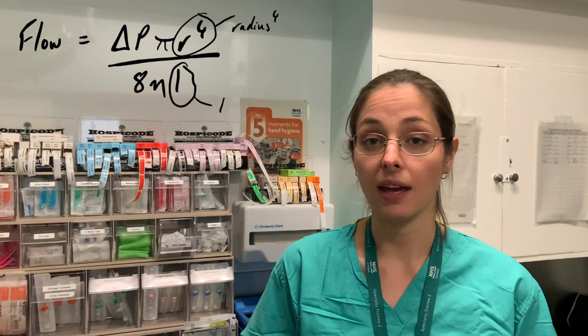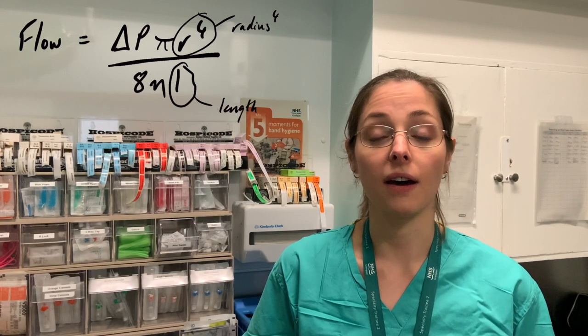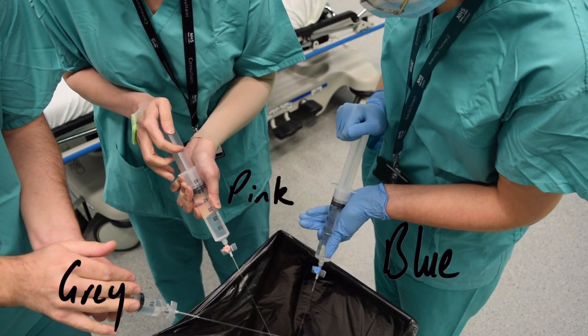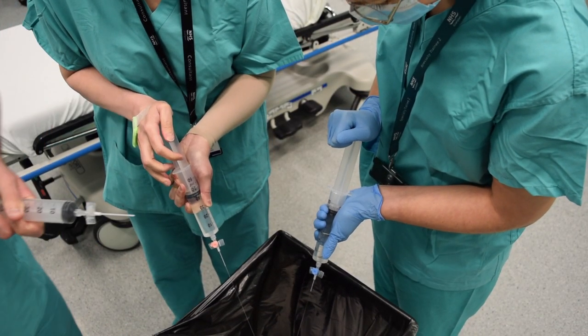The longer any line that you put into a patient, the harder it will be to put the same amount of fluid through quickly. To demonstrate this, you can put 60 mls of fluid through each cannula and see the difference in flow rates, which is really important in emergency situations such as resuscitation.